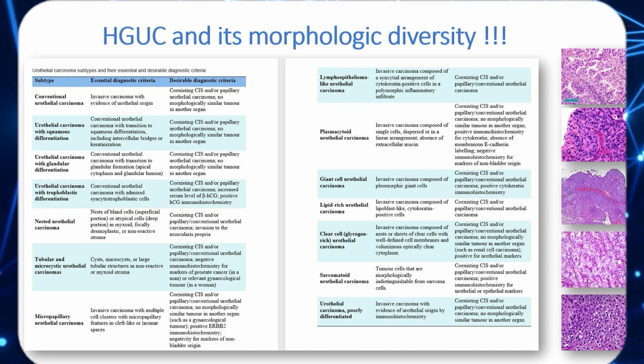Luckily for us, these are rare instances. To find that picture of plasmacytoid as well as the micropapillary carcinoma, seriously, I just had maybe 2 cases out of the, I think, 8 times 5,000 cases we see in our practice. So again, it's a very rare instance that you are going to encounter that.